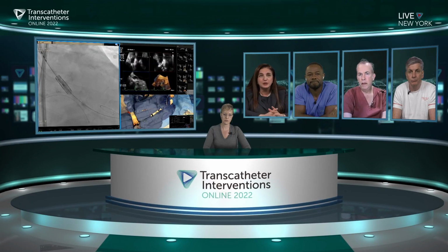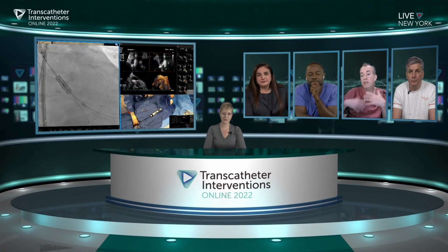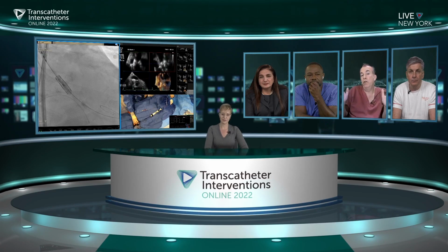But I'd love to hear what you're all thinking about that. It's tricky, because in this case, the patient's aortic stenosis itself wasn't, in fact, unequivocally severe. But on the other hand, as Lars pointed out earlier, in the only study we have, the activation, there was quite a lot of excess bleeding in an era when most TAVI patients also had dual antiplatelets, which is not the case now. So there is an option for saying, okay, you just give them their usual apixaban, you just do the valve, and you don't treat the coronaries unless they have angina. But who knows what the right answer is?